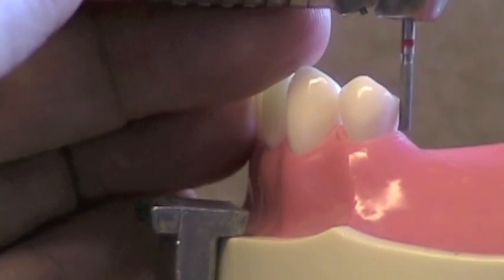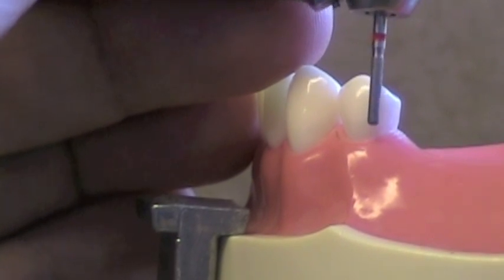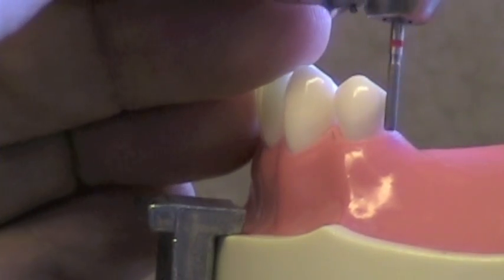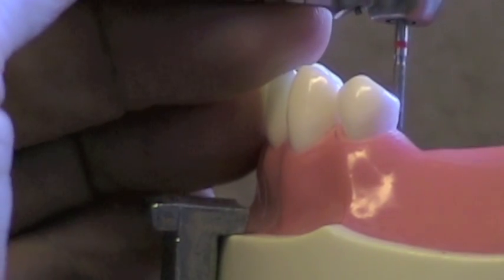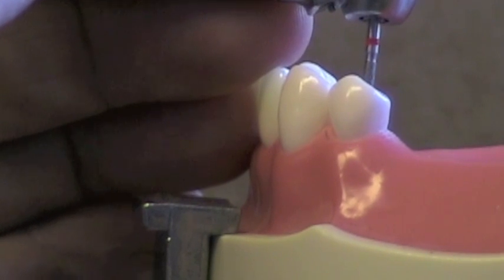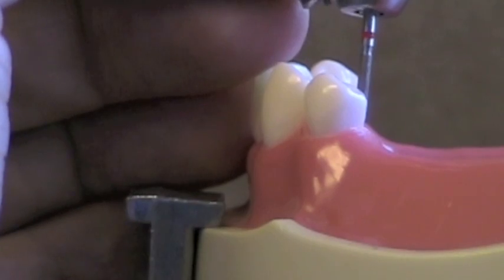Once I have my alignment, I want to go along the distal surface or the proximal surface of the tooth, and I want to roll that burr around from side to side — usually from about midway on the buccal, all the way around the distal to midway on the lingual. Unless there's a real undercut on the lingual, and if I'm going to have a bracing arm there I might go further.